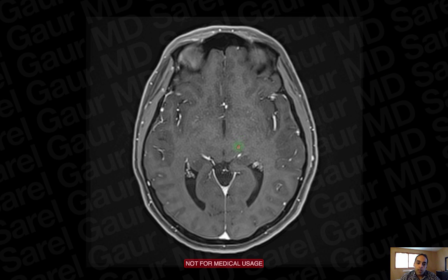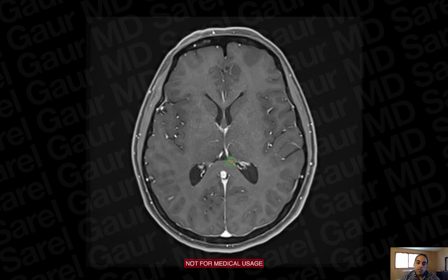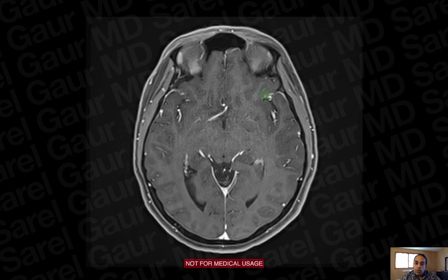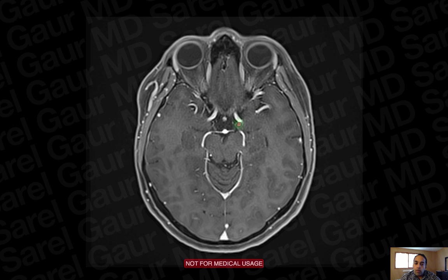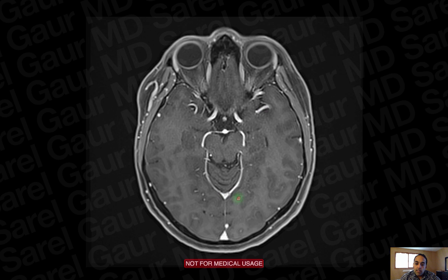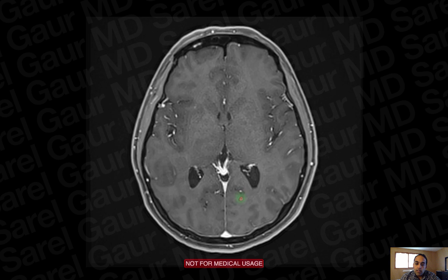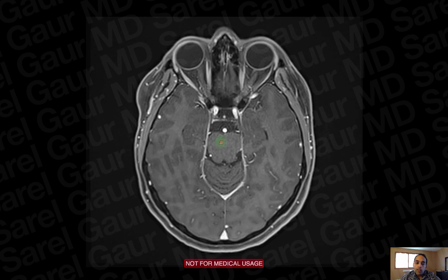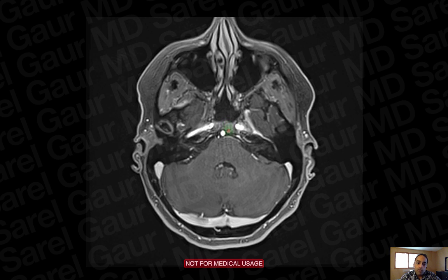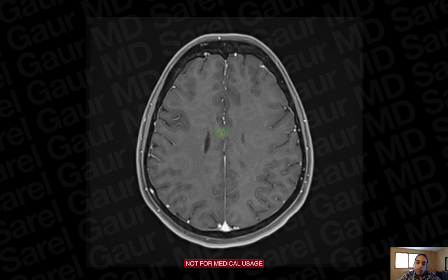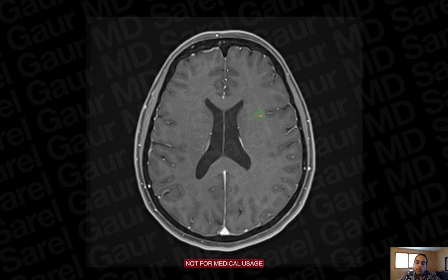This is a very important sequence — the post-contrast T1. I can tell it's T1-weighted because the white matter is high in signal and gray matter is dark. I can tell it's post-contrast because I can see bright intravascular contrast in the MCAs and venous sinuses. This sequence is very important for looking for any enhancing abnormality — for example, a brain tumor would light up and be very conspicuous on this sequence.